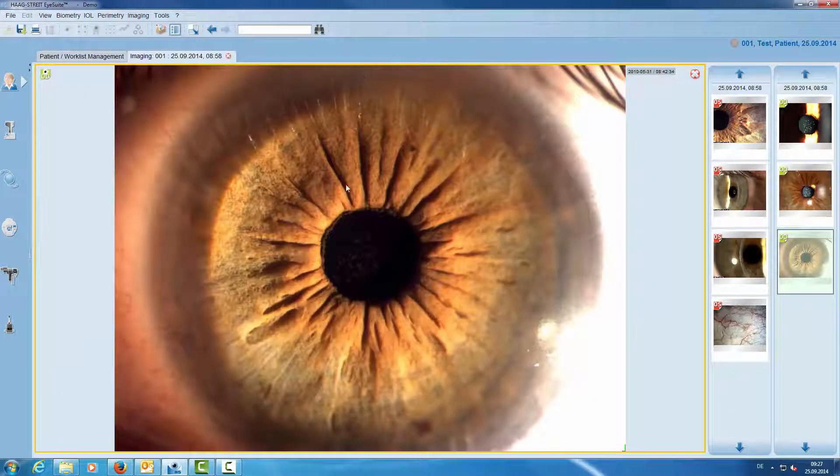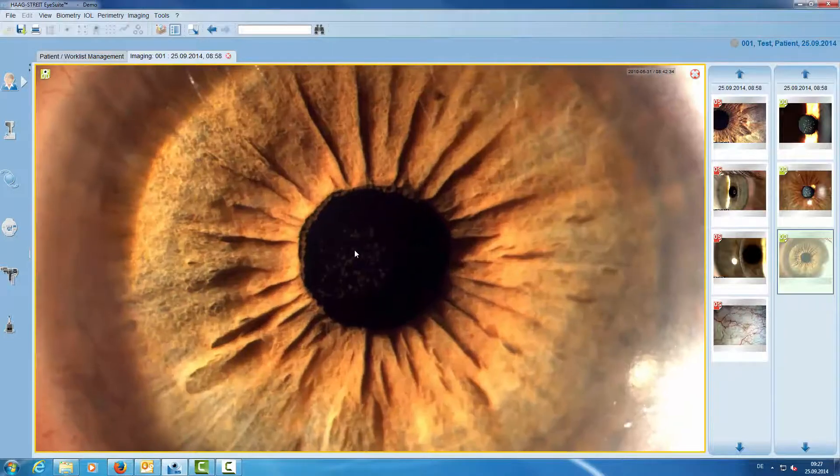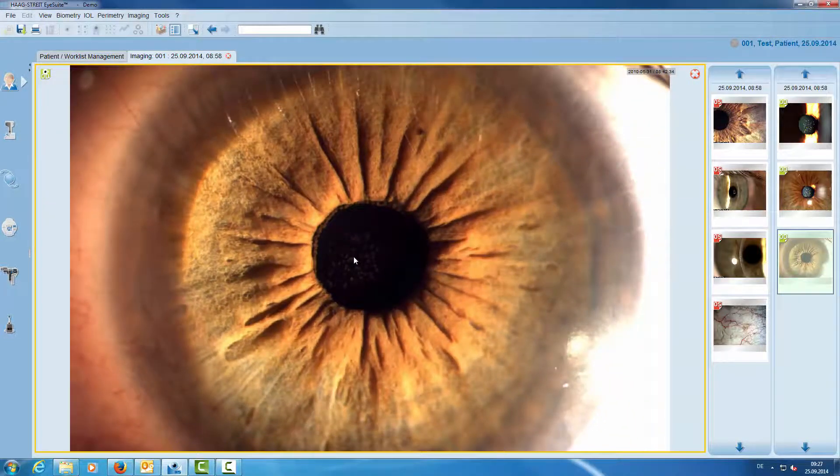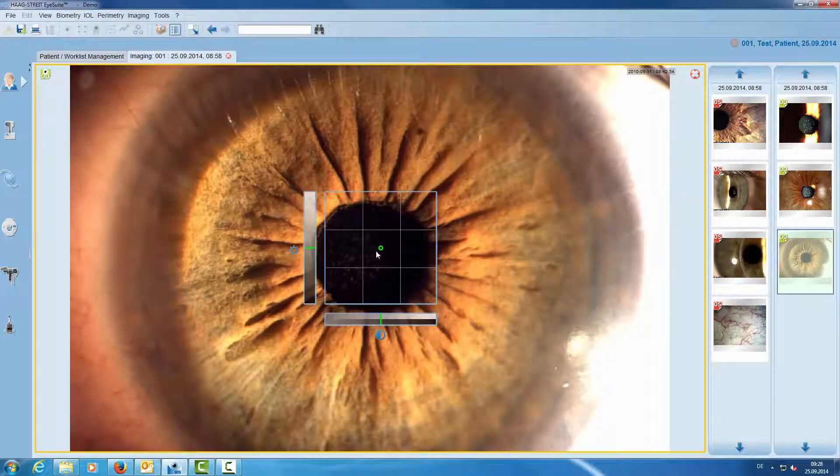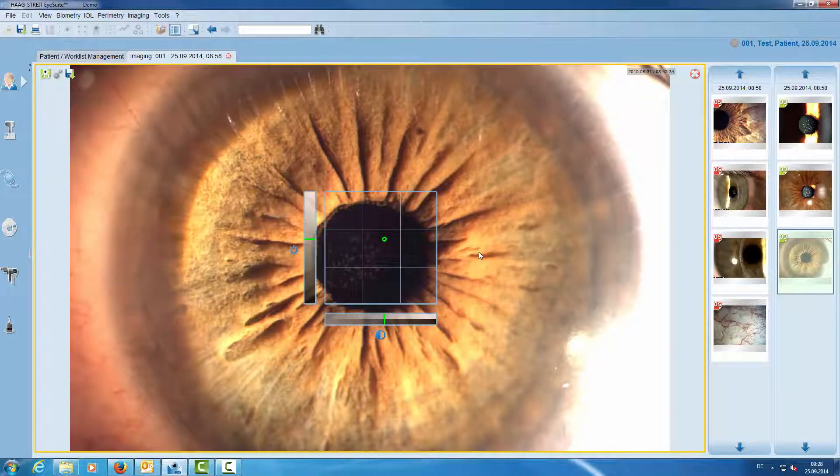With the scroll wheel of the mouse we can zoom in and zoom out. With a double click we activate our own image control where we simultaneously adjust brightness and contrast.